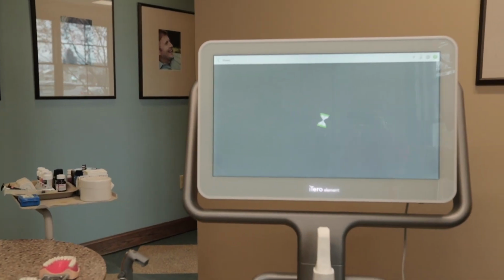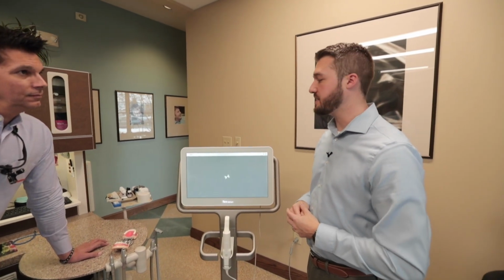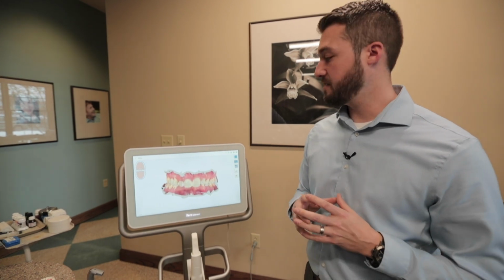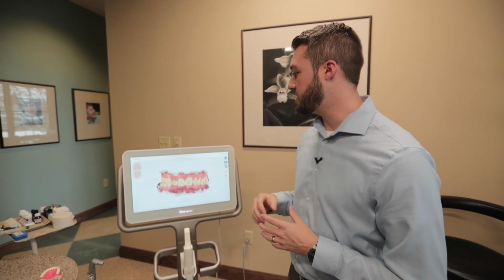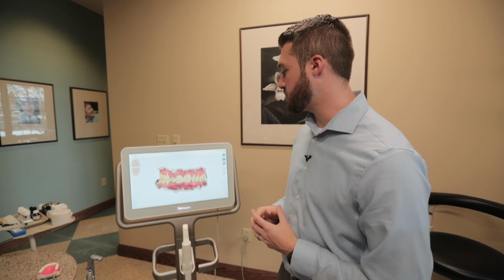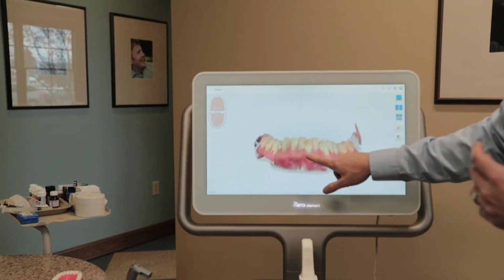Now, what we really like to teach is scanning in the hygiene room. And the reason being, you see patients on a daily basis. The easiest way to provide better care to your current patients is having the best look you can at each of them. So if you can get used to scanning in the hygiene room, you're looking at 3-5 minutes, maybe 7 minutes, of scanning, but really on the lower side, and really capturing the record so we can, again, show patients what's going on. In your hygiene room is where you see these patients on a regular basis.